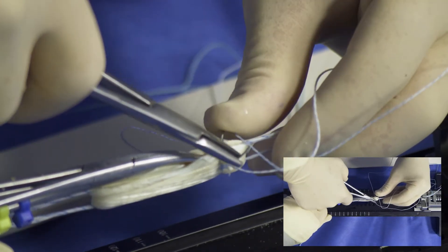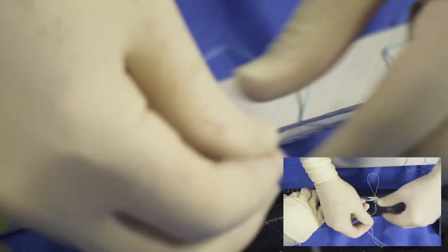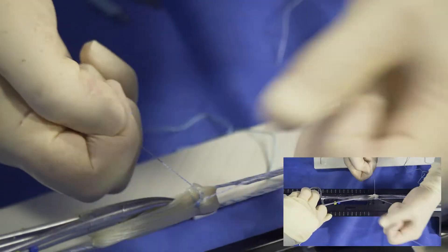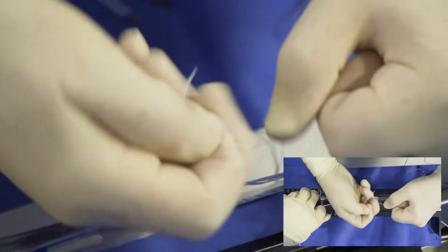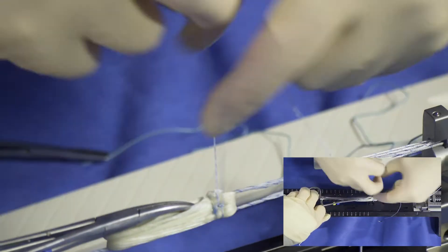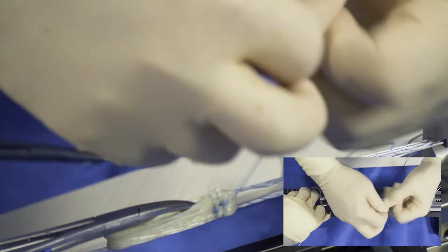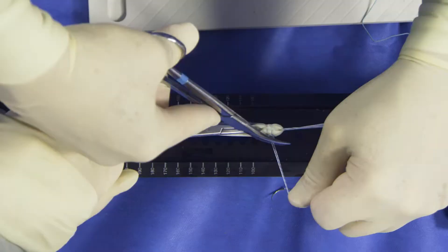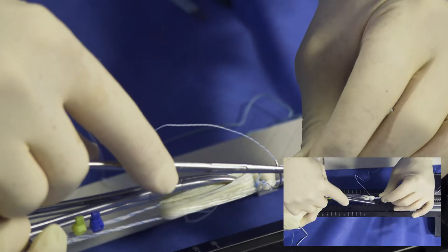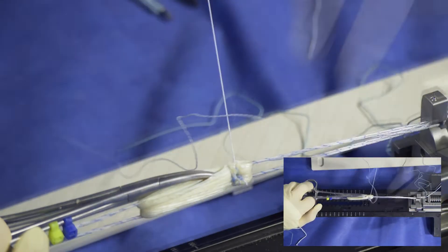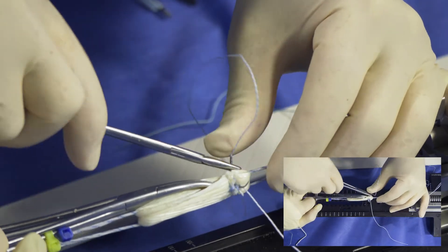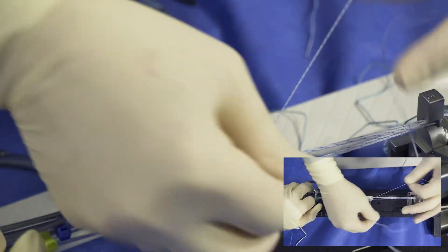This section of the graft will be the portion that will be buried inside the tibia. It is important not to penetrate the ultra button cradle or the ultra button will not tension properly during implantation.